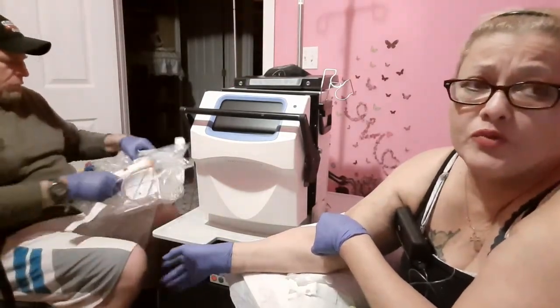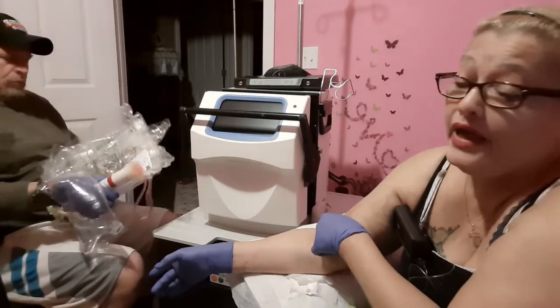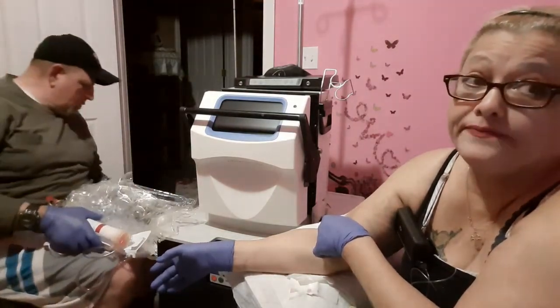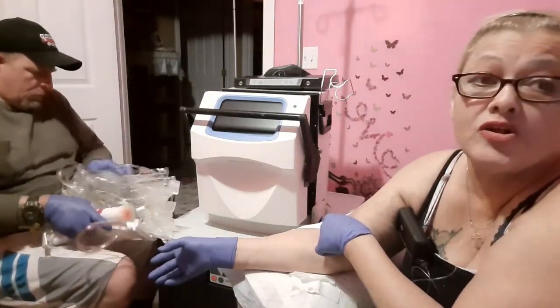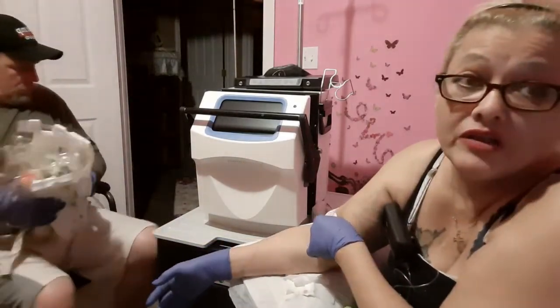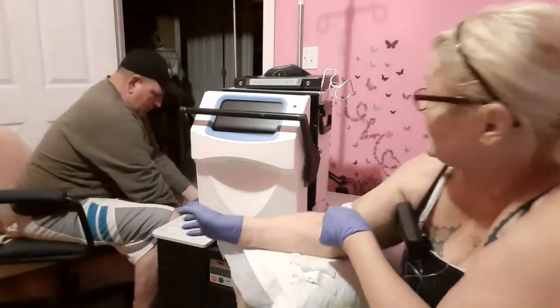Before Hubster goes to work, we'll come in here and prepare a batch and make sure there's no leaks before we put the bag in there. And then if I keep getting it along, then I'm just going to have to call the tech, Alton. I'll call the nurse first, let her know what my plans are and go from there, just in case there's another procedure that I don't know about to do when this happens. But other than that, we're good.